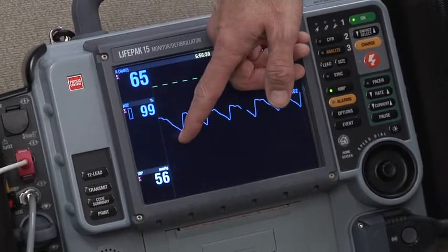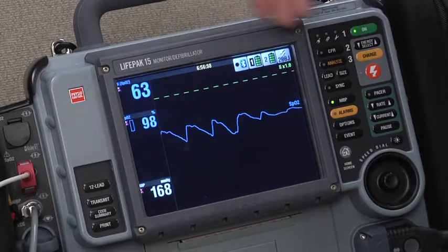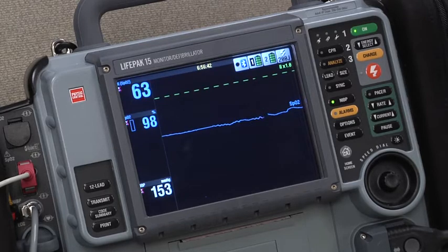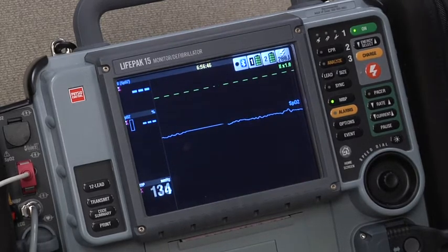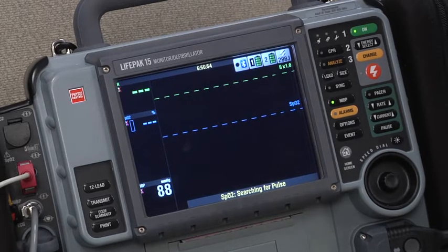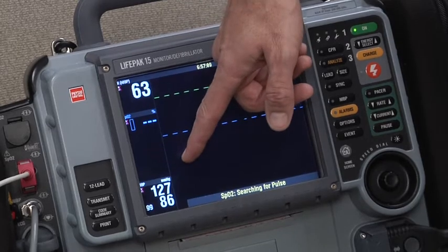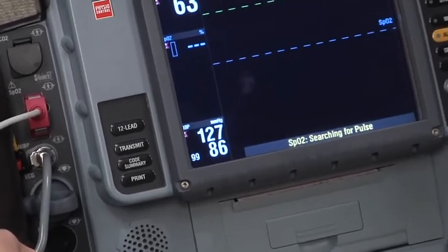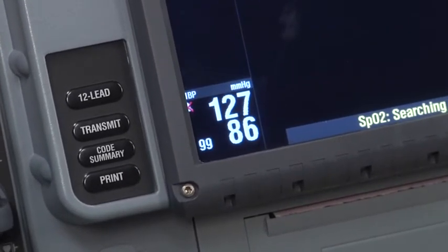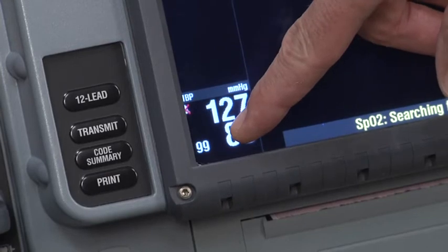We'll see the cuff actually inflate. Because the patient has a pulse oximeter on the same extremity as the blood pressure cuff, we're going to lose our pulse oximeter waveform on the monitor during the time that the cuff is inflated. The cuff is now measuring the heart rate of the patient and the mean arterial pressure. You'll notice it has displayed a heart rate obtained from the blood pressure cuff, not from the oximeter, and it displays a mean in the lower left-hand corner of the screen.